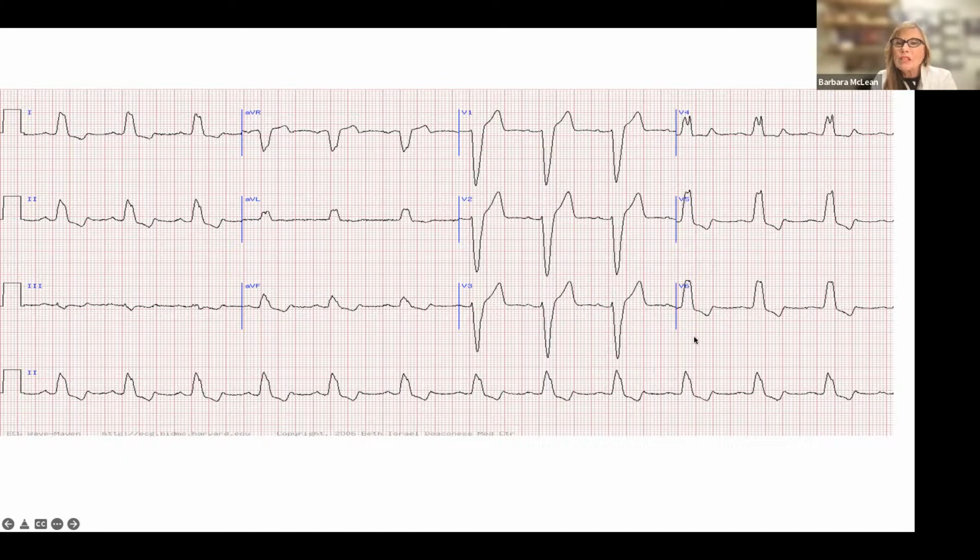I have ST segment depression in my extreme left-sided leads, V5 and V6, and that depression is opposite the QRS, which is upright. And then I go over here and say on the opposite wall of the heart, I have all downward, and I have ST segment elevation. And what I now have to say is, is it greater than 5 millimeters? And no, it's not. So by the way, this is not a STEMI.